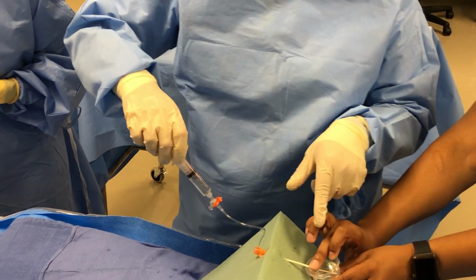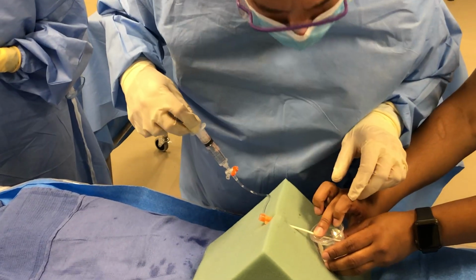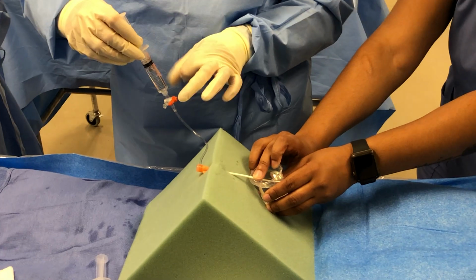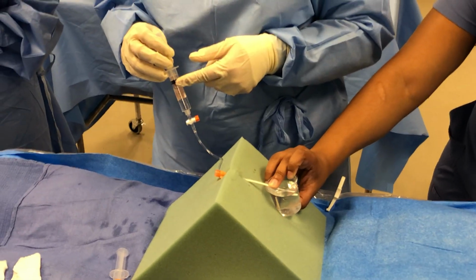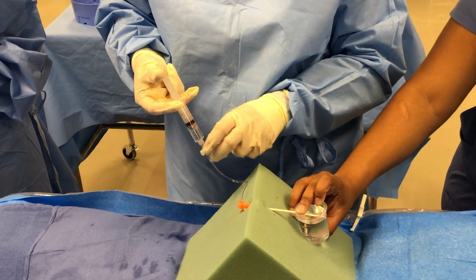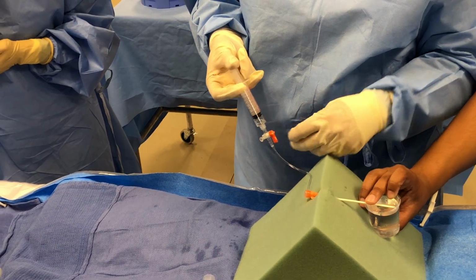I need to use some of my food coloring. I have some actual red food coloring. Is it sucking? I'm getting a lot of air. Oh, you know why? I don't think I really flushed this. I'm not sure. Anyway, you really shouldn't be getting that much air. Be more blood return, but you may have a little bit of air. And then you would flush forward, back into the patient to clear the line, but stop before that bubble would be going in.